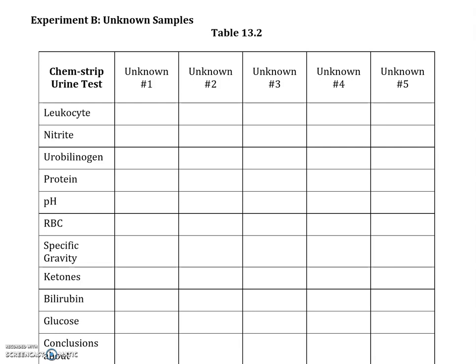and then analyze it for different metabolites. In the lab I always ask to have enough test strips for the pregnancy test, the THC test, and the LH test, which tests for the presence of luteinizing hormone, which is really high right before ovulation. So anyway, I'm going to explain it at the end, but here are your unknown samples.